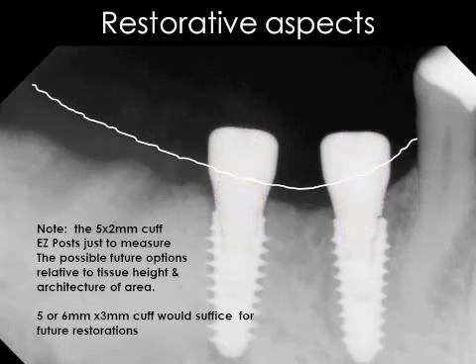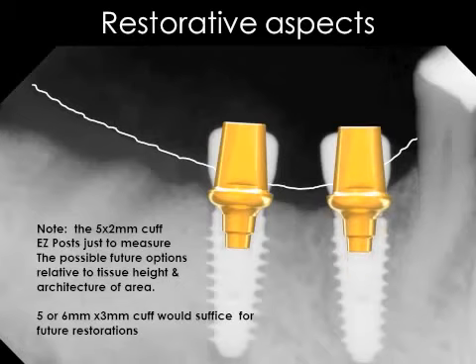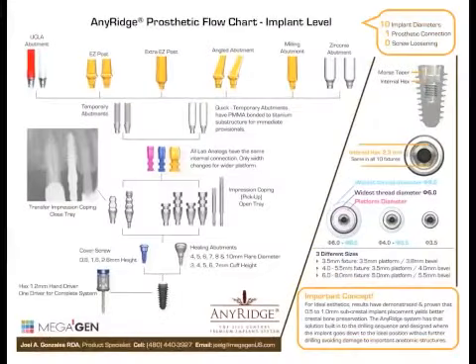Note the different prosthetic options that you see. Just as a little measuring device, you can see there was a 5 flare. Now that's a 6 flare. Note the different emergence profiles you can deal with.